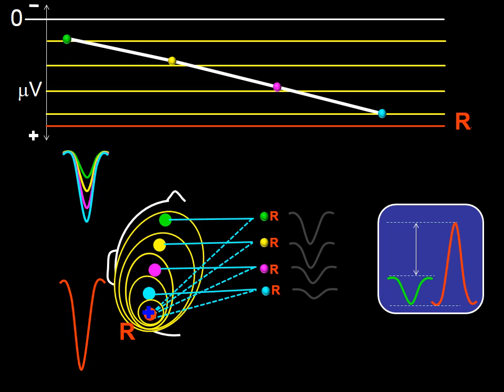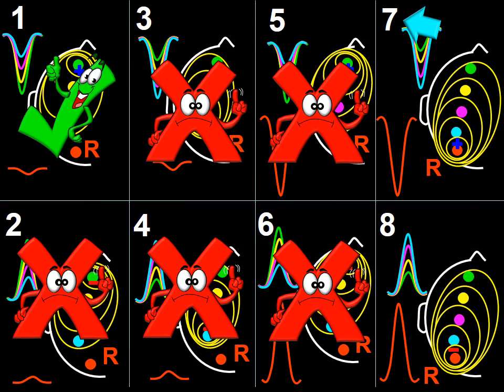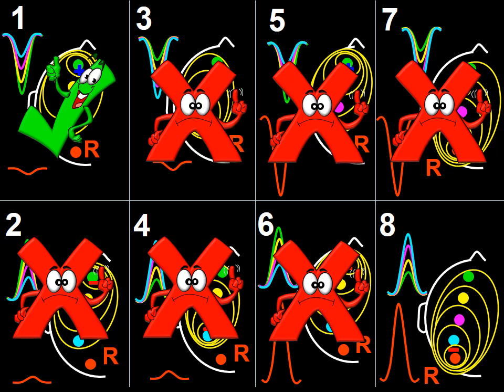Then, when we bring the green wave into the differential amplifier box, the product, as expected, is a negative wave. This is not consistent with the wave in question arising from the first derivation. Hence, option 7 is not a sound option. Next, we must consider option 8.